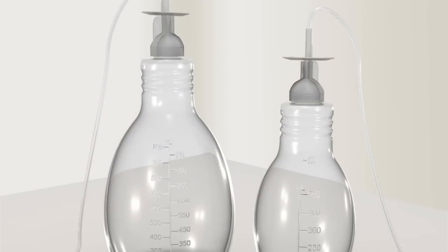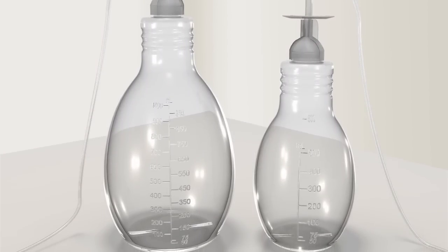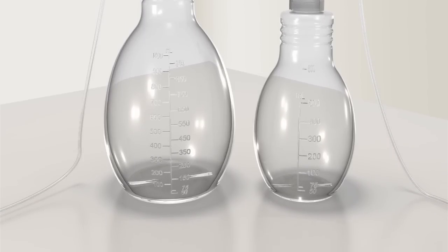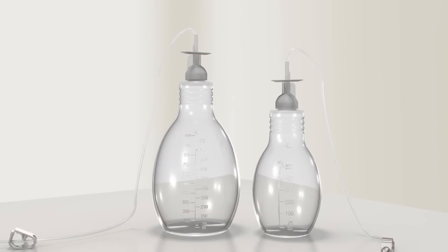You'll drain your fluid into Plurex drainage bottles specifically designed for use with your Plurex catheter. These bottles come in two sizes: 500 milliliters and 1000 milliliters. Preparation and use of each bottle is the same regardless of size.